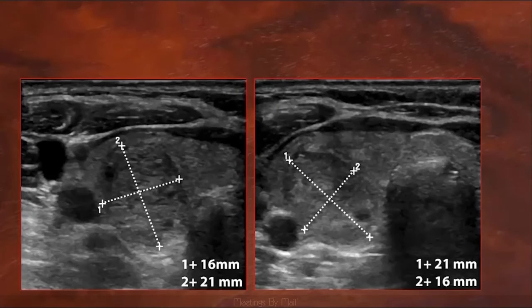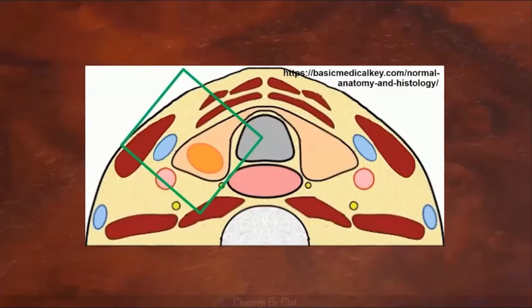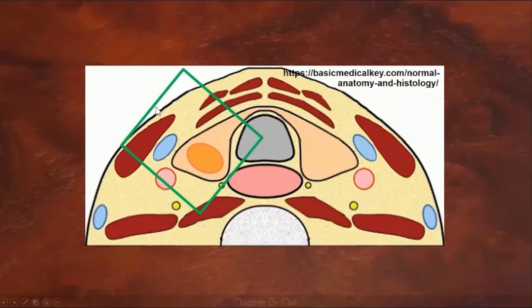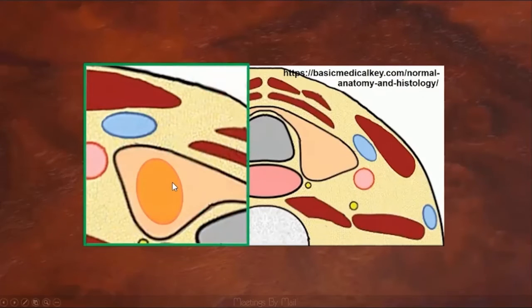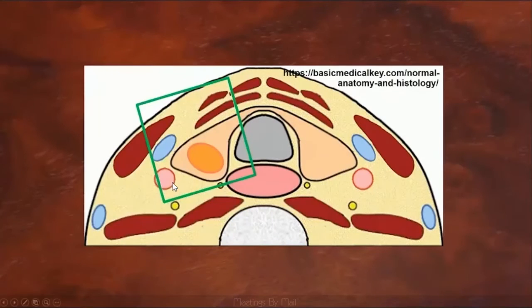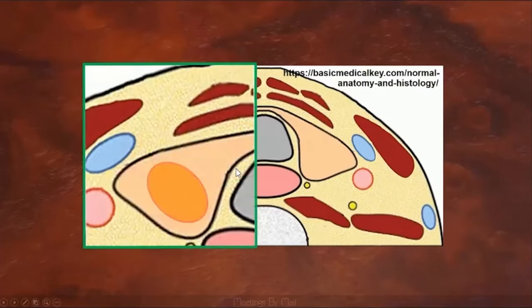This is an example of a nodule that looks taller than wide on the left image and wider than tall on the right image. Why does that happen? It's because the apparent orientation of the nodule depends on the location of the transducer. When the transducer is in a lateral position, the nodule will appear taller than wide. On the other hand, when the transducer is in a more anterior position, the nodule will actually appear wider than tall.